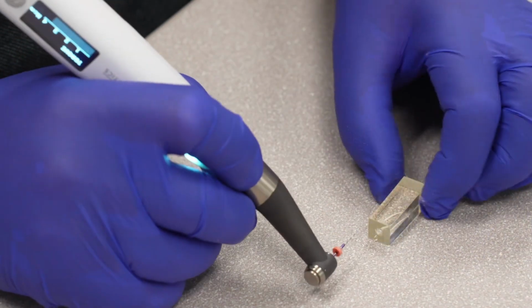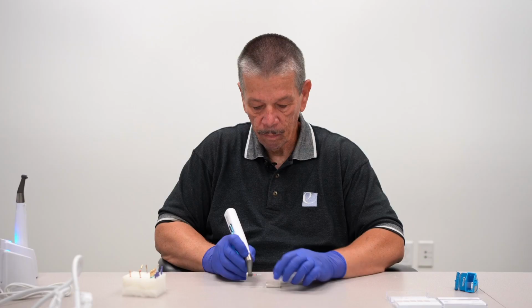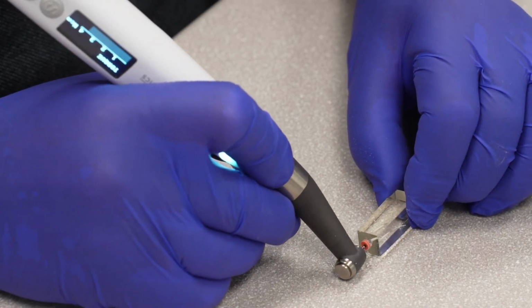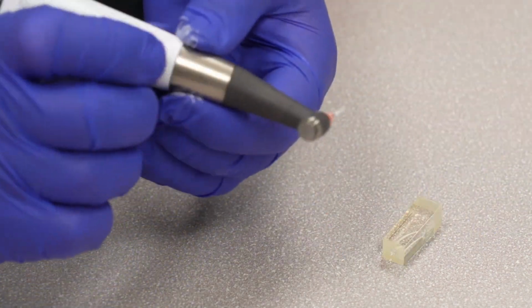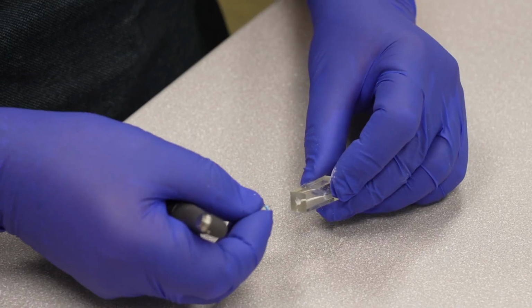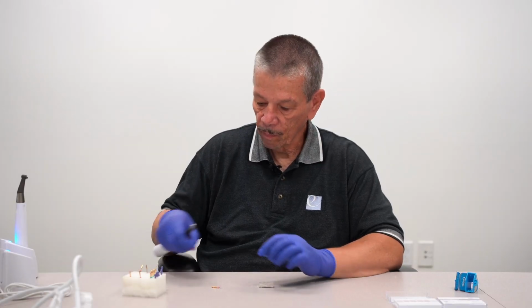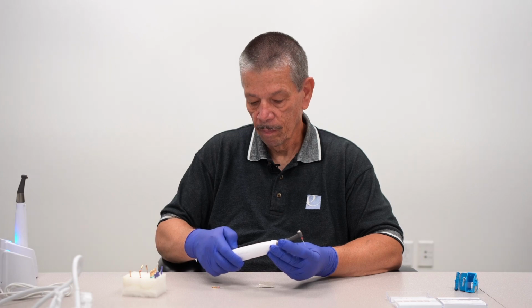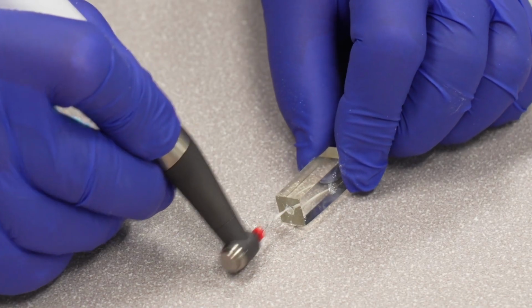You should be cleaning your flutes while you do that. And then we're going to again negotiate, clean all the debris out. We're going to take our ZenFlexONE and reciprocation motion, and go back in, and we're going to brush on the way out.